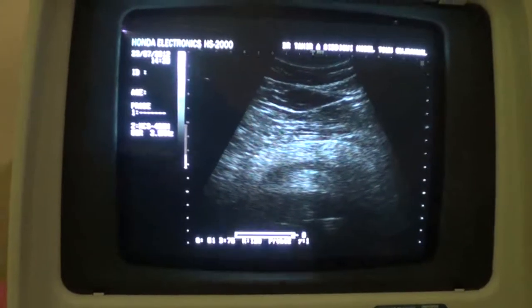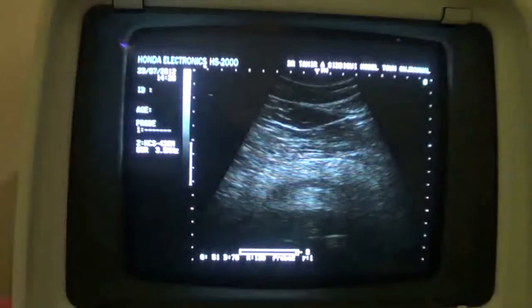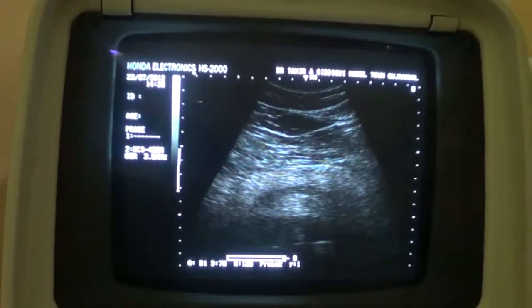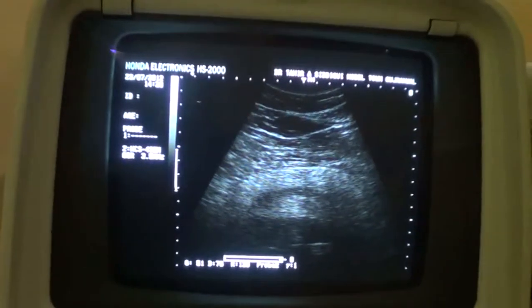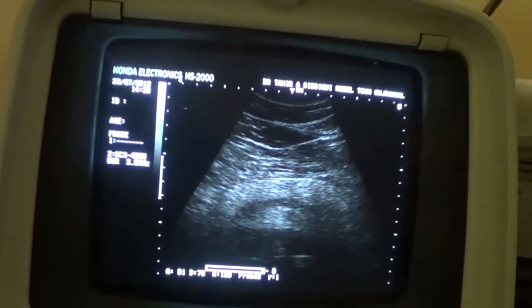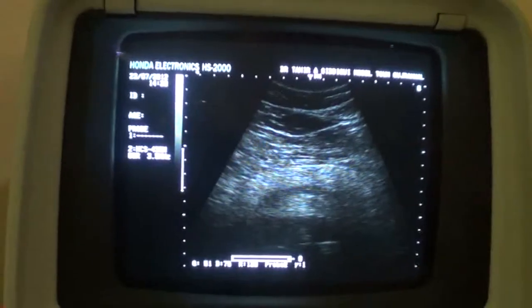This is the fatty pancreas — sorry, fatty pancreas — in transverse section.